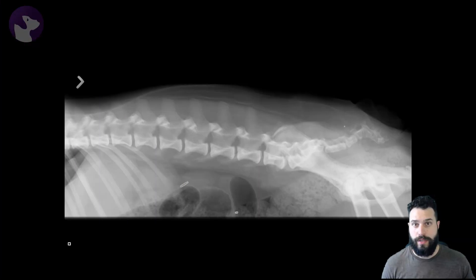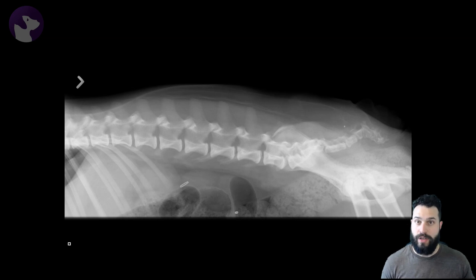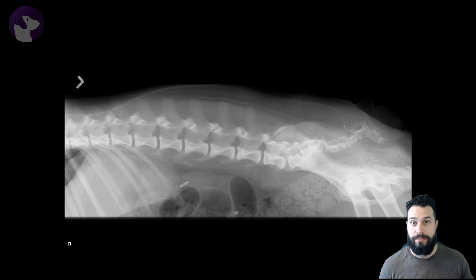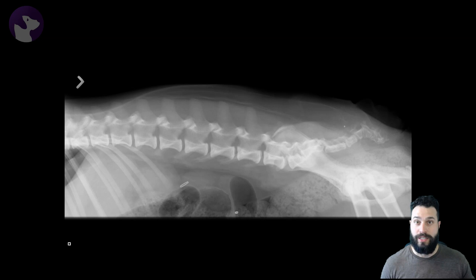Hey folks, wanted to chat quickly about the different radio opacities that we identify on our radiographs. The opacity of a structure is related to its inherent characteristics and depends on how much of the x-ray beam is being attenuated by that structure. Structures that attenuate less of the x-ray beam are going to be more lucent, and those that attenuate more are going to be more opaque.